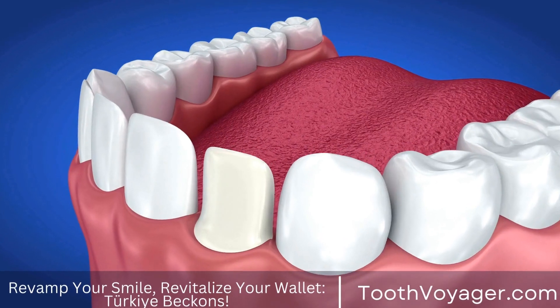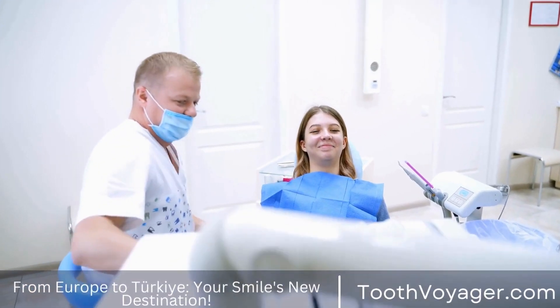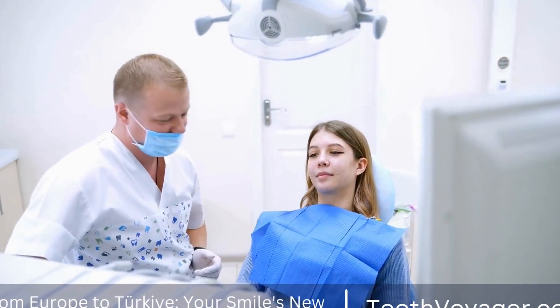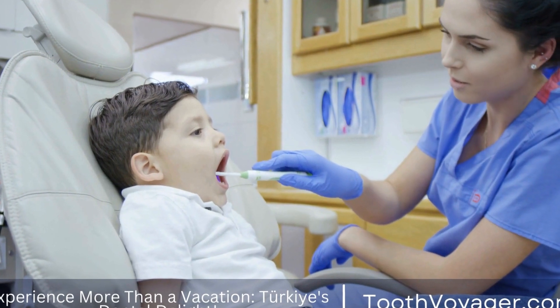After the bridge is fabricated, it is cemented into place using dental cement. The dentist will make any necessary adjustments to ensure that the bridge fits comfortably and securely. With proper care and maintenance, dental bridges can last for many years.